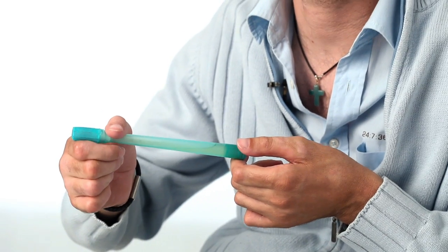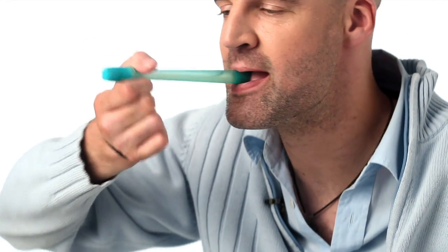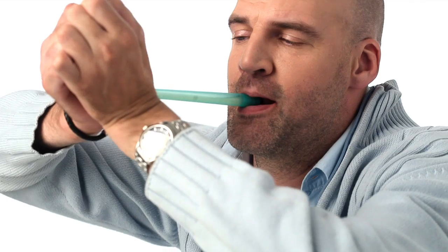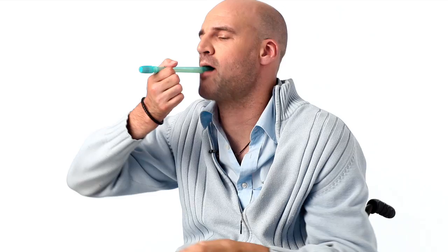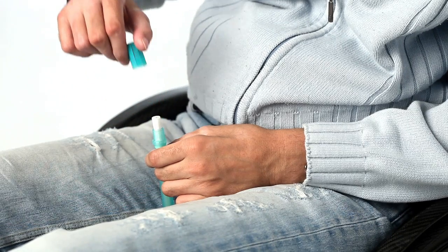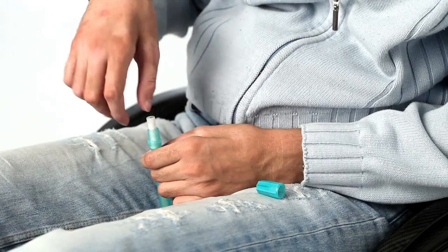First thing to do is to unscrew the lid from the container. Now the lid is loose and I'll just take the rest like this, and put the lid on my lap for later use.